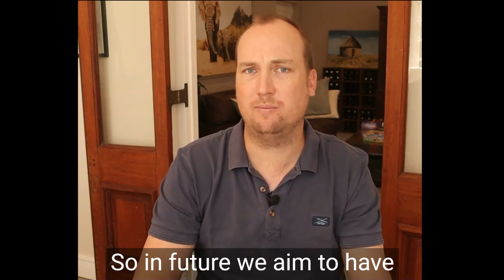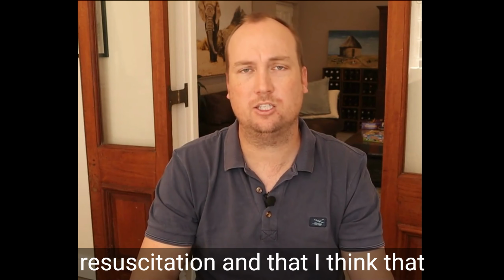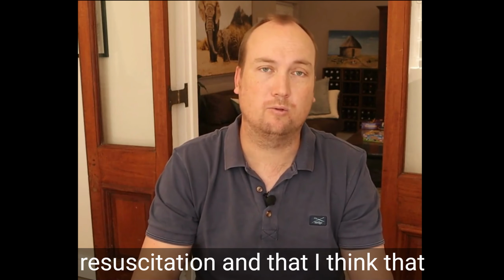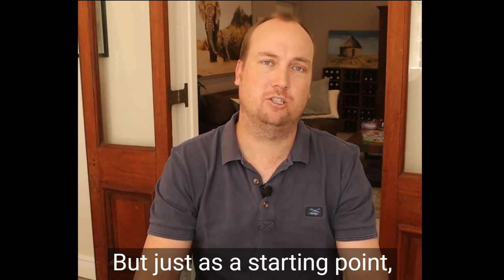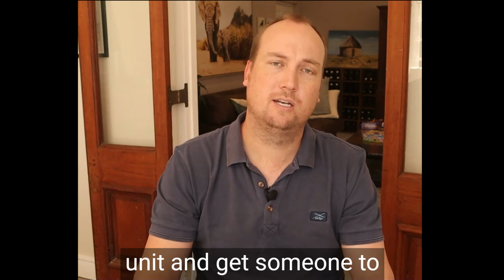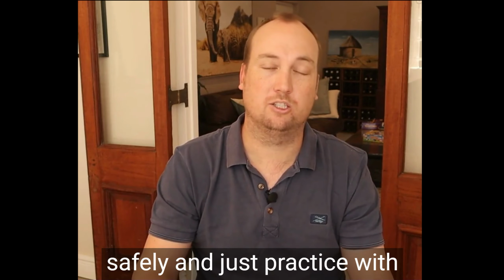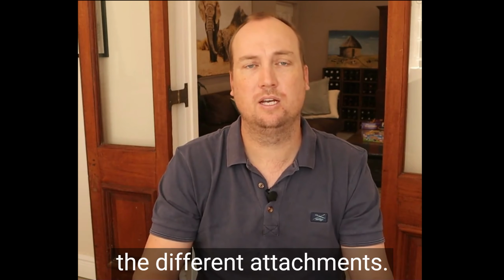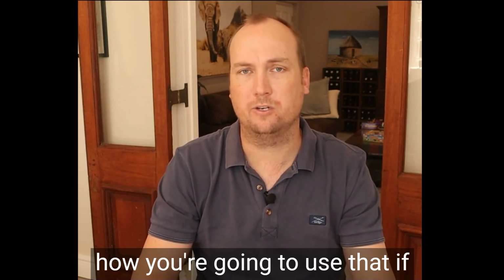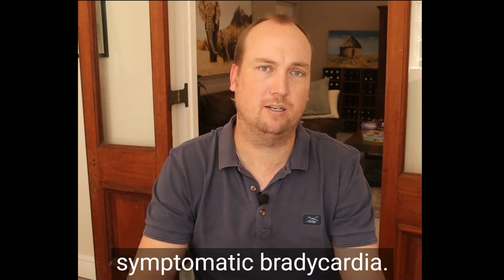In future, we aim to have a talk on certain aspects of resuscitation, and I think that will be beneficial for everyone. But just as a starting point, find the defibrillator in your unit and get someone to explain to you how to use it safely, and just practice with the different attachments, and in your mind go through how you're going to use that if you have a situation of a severe symptomatic bradycardia.